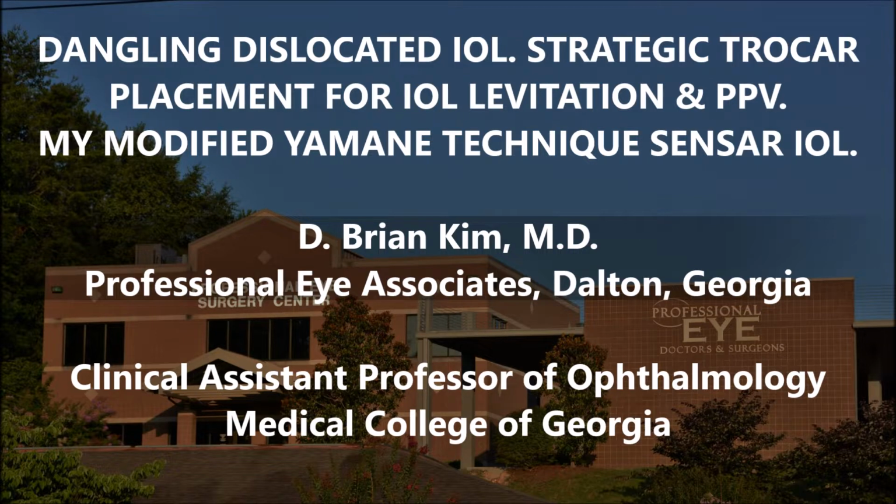And so this is very important because as I look at this lens at the slit lamp exam, it's very obvious that the lens is sitting posteriorly. And so you have to think to yourself, okay, as a patient sitting upright, it's sitting very posterior. Therefore, when the patient's lying down, it's going to fall even further back. And so you have to ask yourself, will I be able to actually get to this lens? And if I have trouble getting to this lens, what strategies can I employ in order to get that lens up? And you're going to see a really cool technique that I did on this case.